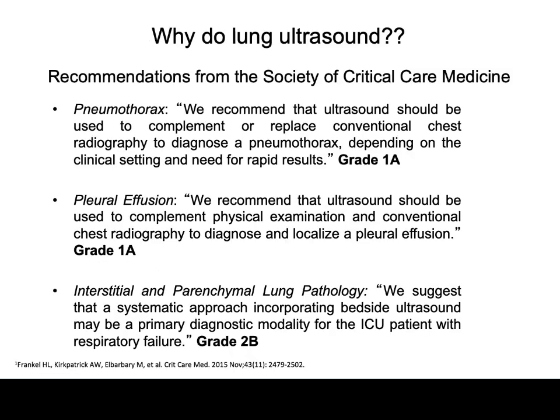The Society for Critical Care Medicine makes a few recommendations on the use of lung ultrasonography in respiratory failure. For pneumothorax, they recommend that ultrasound should be used to complement or replace conventional chest radiography to diagnose a pneumothorax, depending on the clinical setting and need for rapid results.